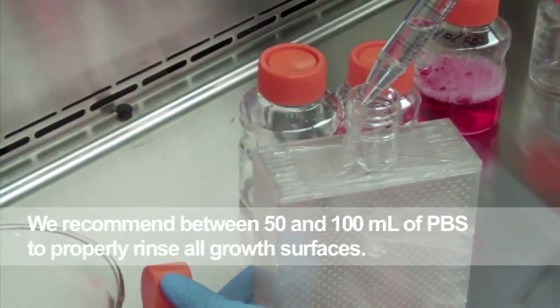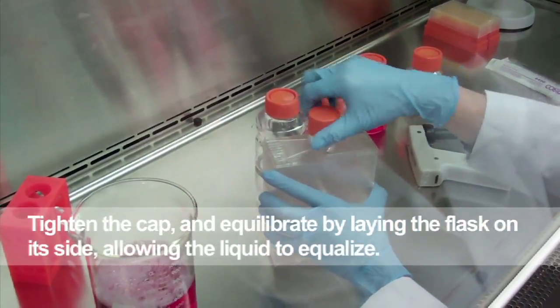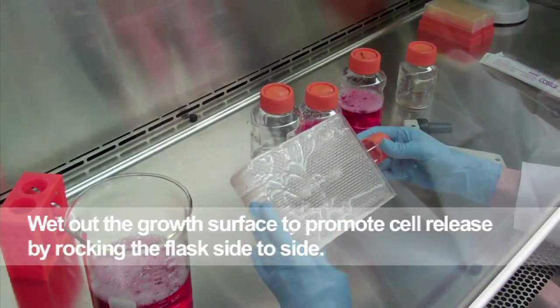We recommend between 50 and 100 milliliters of PBS to properly rinse all growth surfaces. Tighten the cap and equilibrate by laying the flask on its side, allowing the liquid to equalize. Wet the growth surface by rocking the flask side to side.